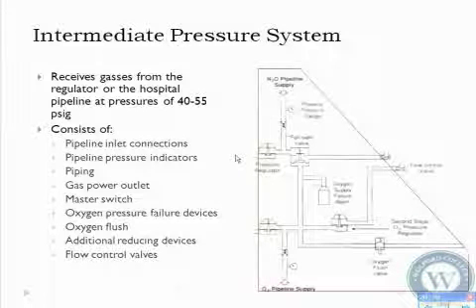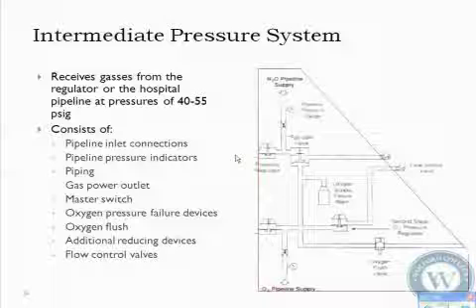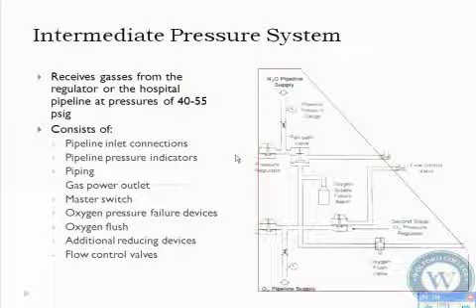Yes. The computers all have an internal battery backup. It's going to last, I believe, around 30 minutes for the Apollo, with it turned on and fully functional. Anyway, you shouldn't really ever have to use that. It'll switch on immediately, so the machine will never come off if your power goes out on the main supply, until it switches over to the emergency backup. All right? So just keep that in mind also.